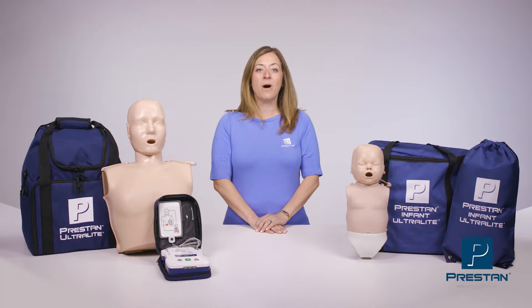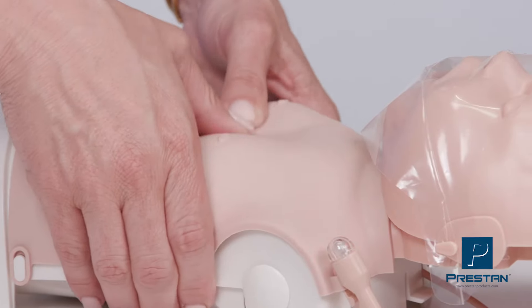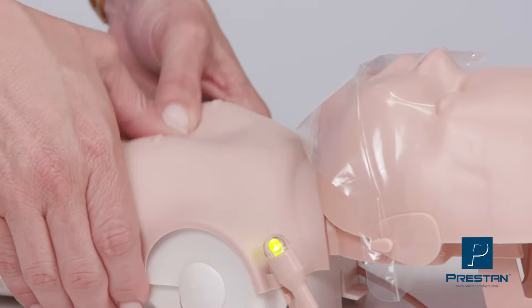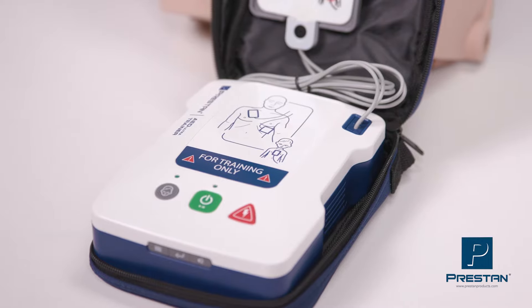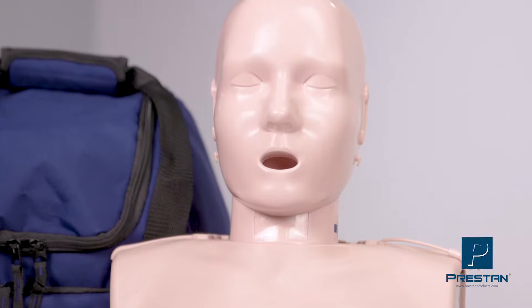Prestan has been providing high-quality, affordable CPR training solutions with instant feedback for over a decade. Our anatomically correct designs, durable construction, and intuitive feedback have successfully prepared students with the confidence and skills necessary to perform high-quality CPR when needed.